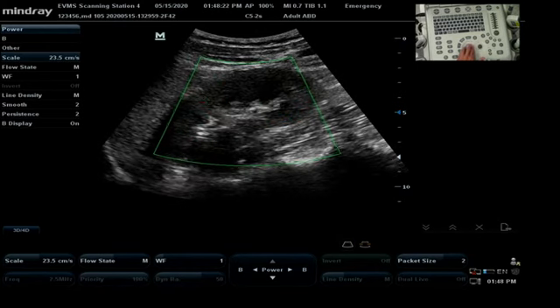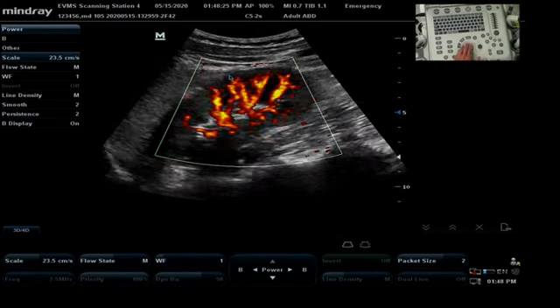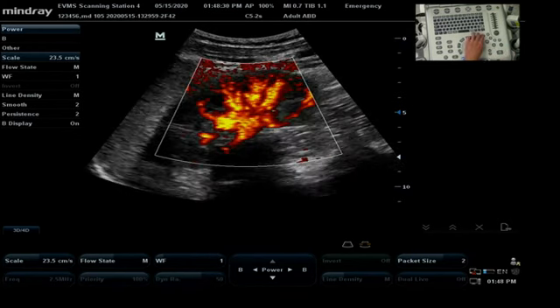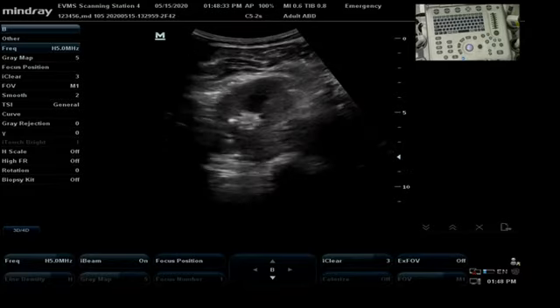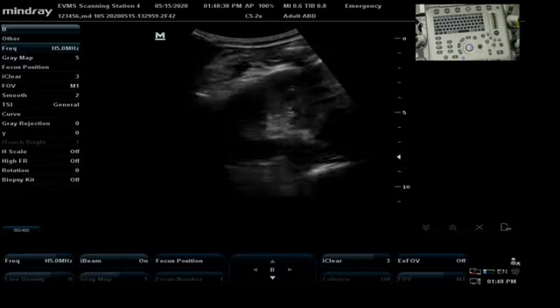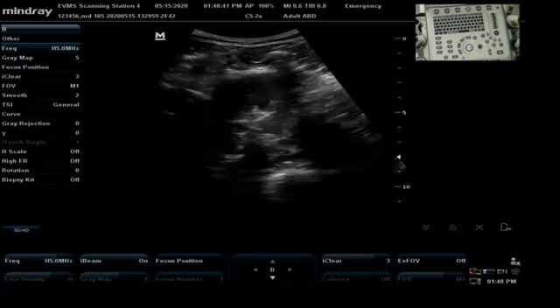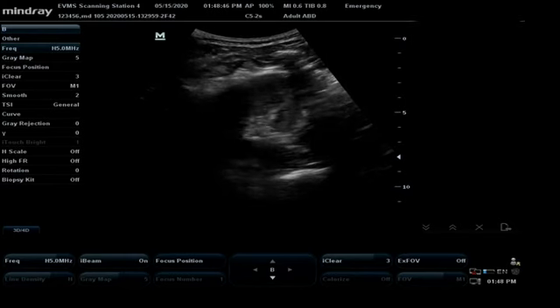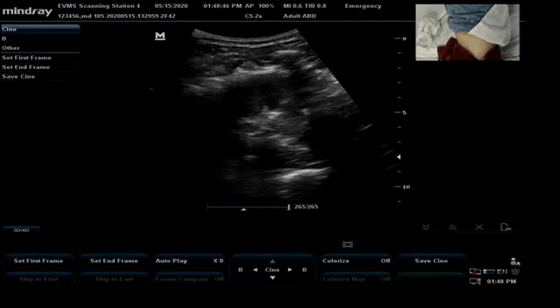You start to see it getting closer to the edge of the cortex because of that increased sensitivity. Breathe, please. One more thing before we leave is just to make sure, quick look, we look around, we didn't miss anything, we've confirmed our poles, we've looked at the kidney with color, and so that is it for our scanning exercise. Do remember that this might be part of a larger protocol, and you might have a requirement for looking at the bladder.